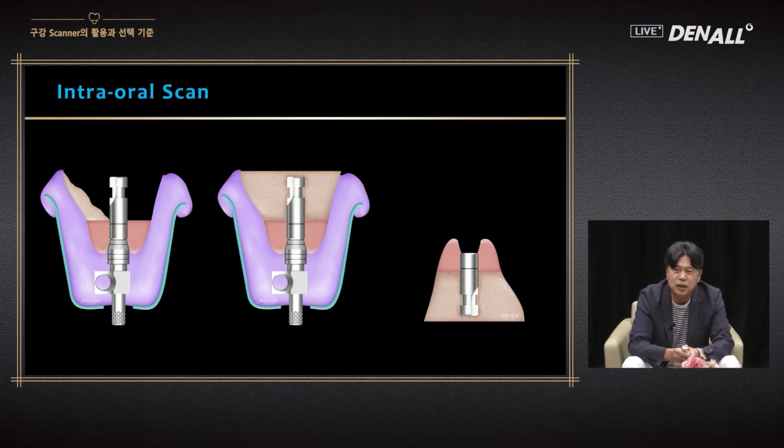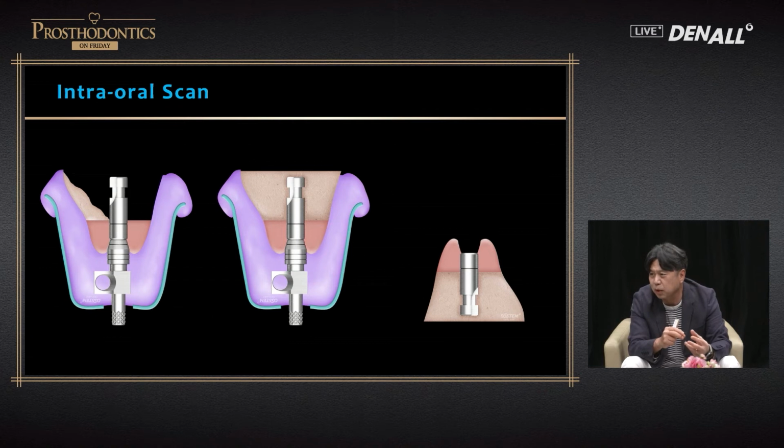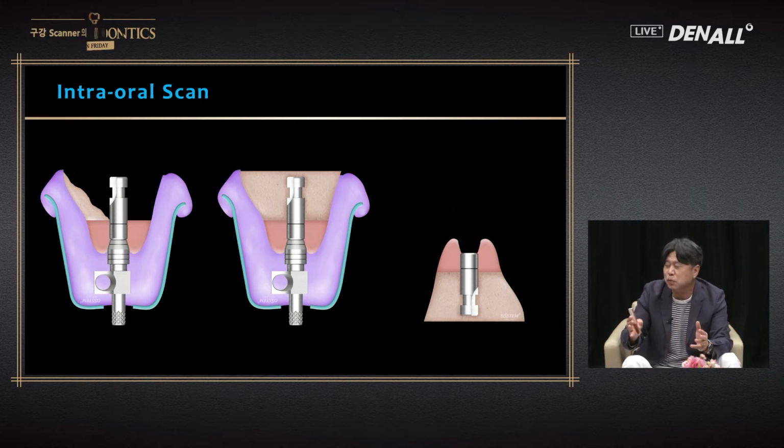Some days ago, recently, I use Osstem implants in most cases. I have a patient who received another company's implants, and from abutment to superstructures that need to be replaced, we have only Osstem scan bodies. And I was discussing the problem with our staff. We may have to do analog impression taking, and our staff got mad. We cannot do that. Just up to 5 years ago, we naturally took the conventional approach for impression taking. Now, our staff do not want to go back to the analog way of impression taking.